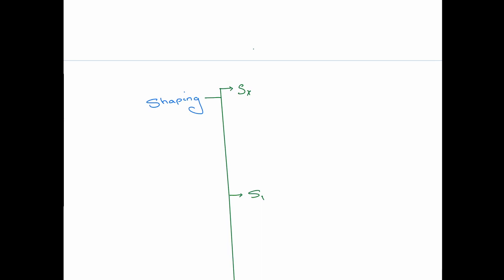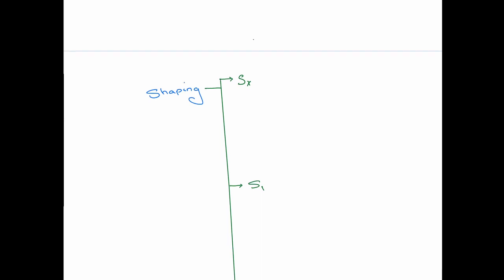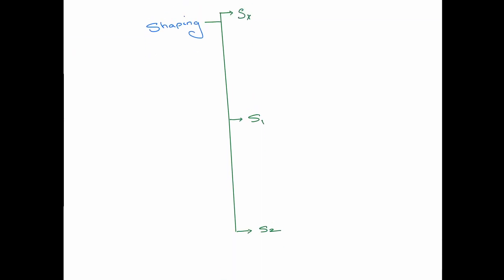Now we have shaping files and finishing files in ProTaper. If you have used it, you'll see that there is a shaping file, shaping the canal, and finishing the apex. Finishing is basically to the apex part. So the shaping files are SX, S1, S2, that is S for shaping, and the finishing files are F1, F2, F3, F4, F5. Let us discuss them separately.